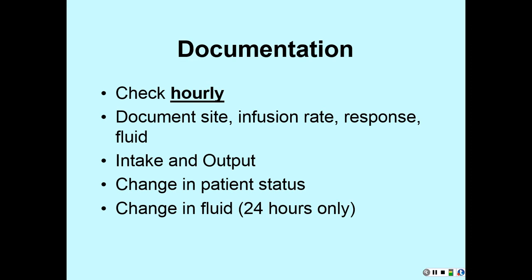And just like we talked about with the NG tubes, at the end of your shift, you're going to note how much IV fluids your patient has had. Some places mark the bag and do all that business. That's kind of rare now because you've got pumps that tell you. So you go in at the end of your shift and you pull up on your pump how much has been infused. You write that number down and then you clear out your pump.